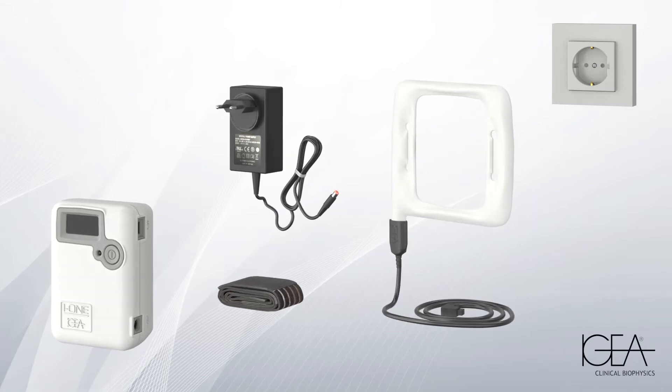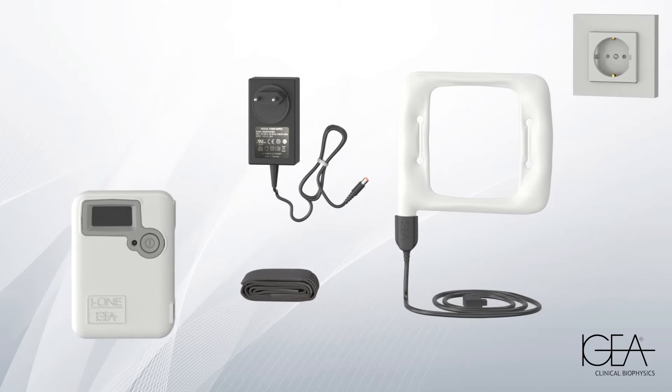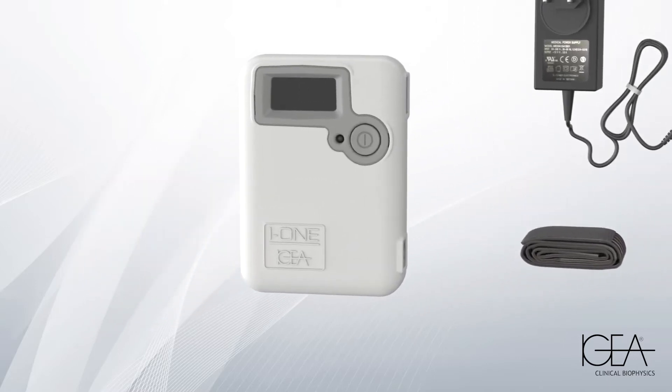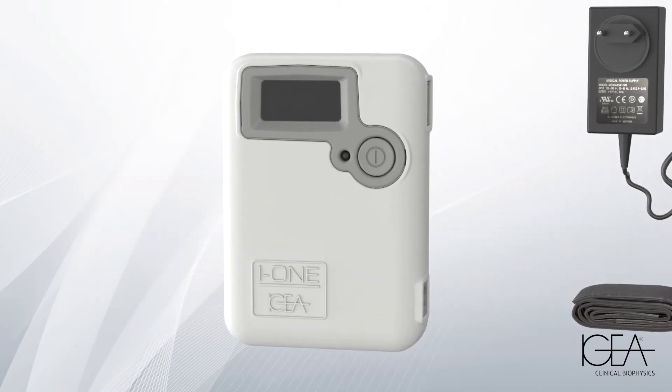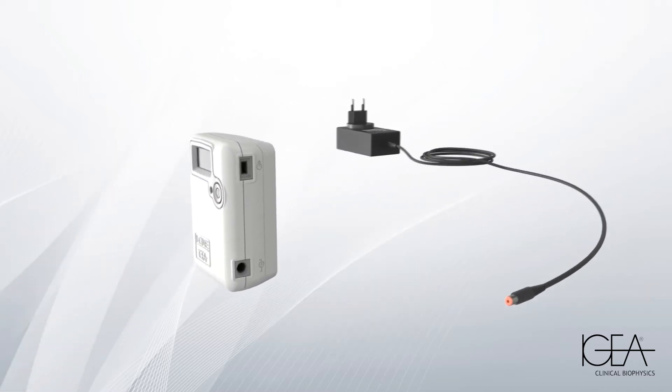I1 TPC is a specific medical device for post-surgical joint treatment. It is capable of effectively reducing inflammation, pain, and swelling, and enables a faster recovery after surgery. It is very simple to use. To fully charge the battery, connect the generator to the charger.